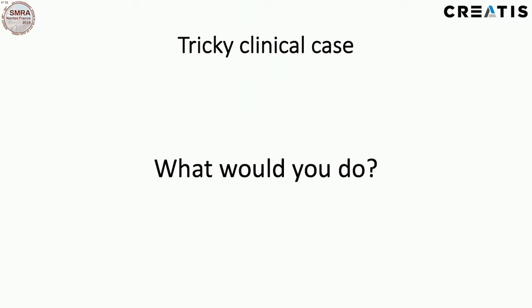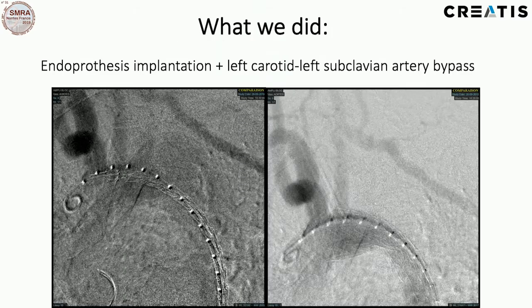and hope for the best. We chose to place another prosthesis at the level of the primary entry to close it, because we hoped it was not infected at this level, and we didn't do anything at the level of the rupture. Our way was a bet: to close the primary entry to stop the perfusion of the false lumen, and it was a septic patient, so if he was too septic, to drain the collection, but to drain the collection we have to be certain there is no more flow.